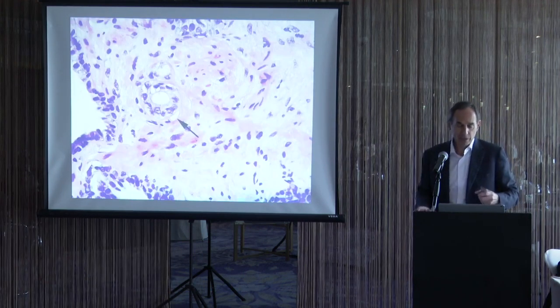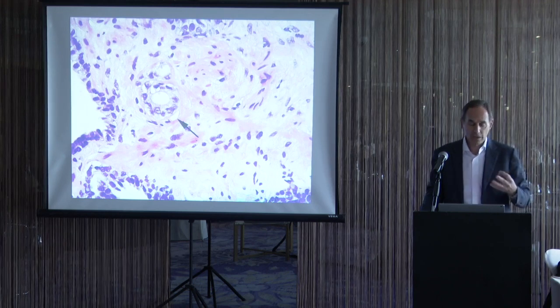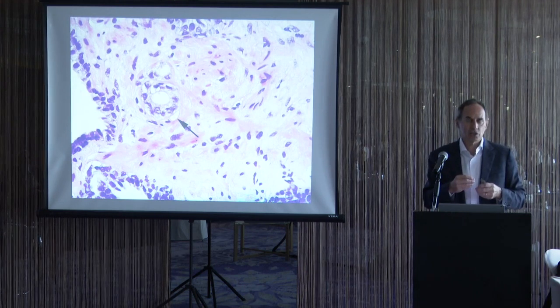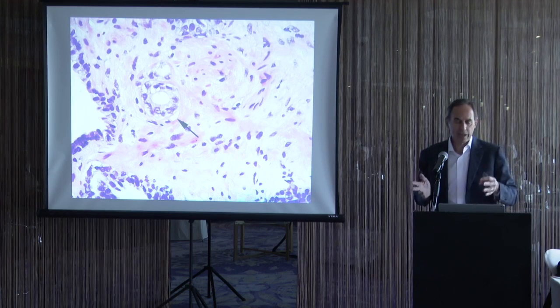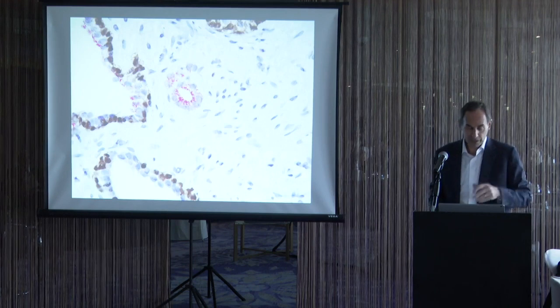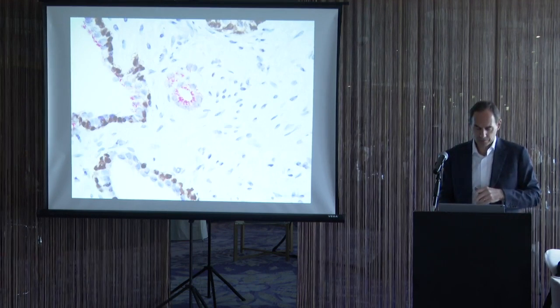And then sometimes you call it atypical because there's just not enough glands. So here there's one gland that's atypical, but it's not tightly tucked in between that benign gland like I showed you earlier. Most likely this is cancer, and I would probably say it's highly suspicious for cancer, but I wouldn't call cancer on this one gland in this setting, even if it's negative. Again, probably is cancer, but I would say highly suspicious for cancer.